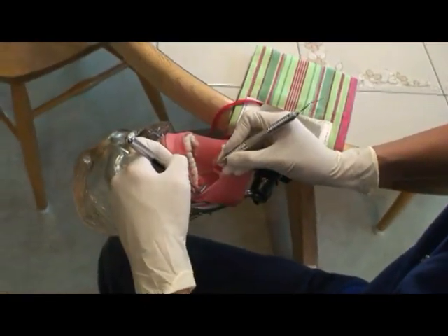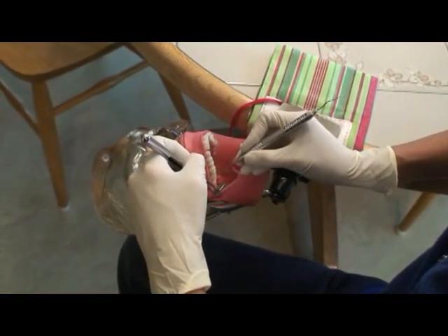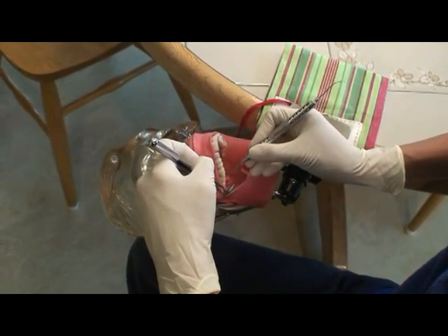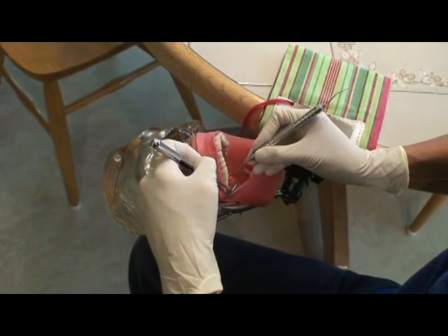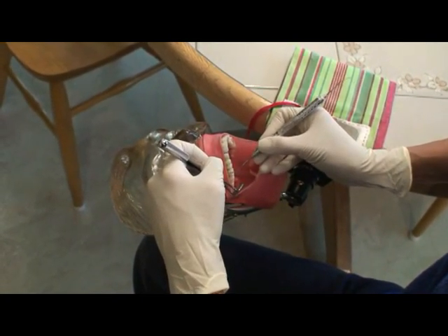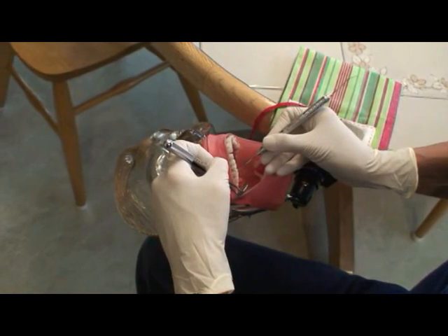Upper right facial, pointed mesially, adapted to the tooth. Walk it back to the trailing edge. And roll it in interproximally.